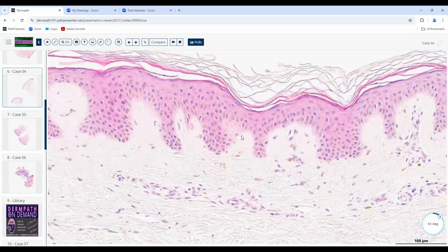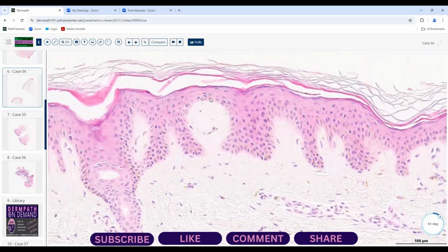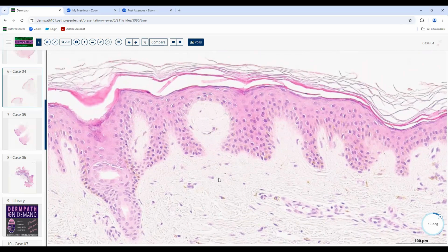So this is the board question. They'll say something along the lines of, what type of amyloid is this? Is this associated with systemic illness, like, say, someone that might have multiple myeloma? Is it something that's just coincidental? Well, obviously we know that this is comprised of degenerated keratin. So it's a different type of amyloid than the amyloid that comes from an immune-mediated process. This is somebody that's got myeloma, for example. The amyloid that you see in that condition doesn't look like this.